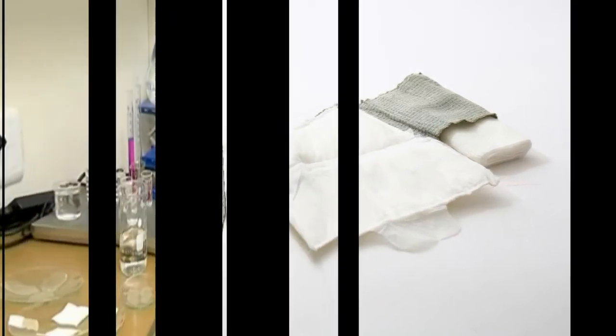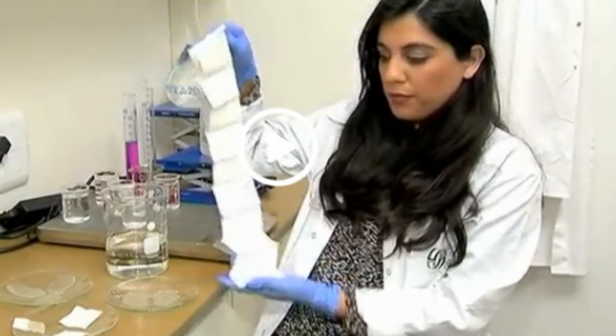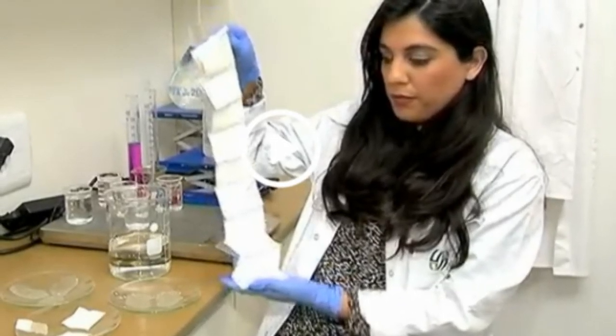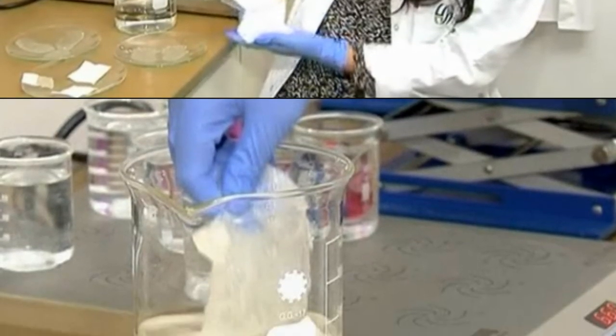the bandage, called wound clot, not only stops severe bleeding within minutes without the need to apply pressure on the wound, but also enhances the blood's natural process of clotting.